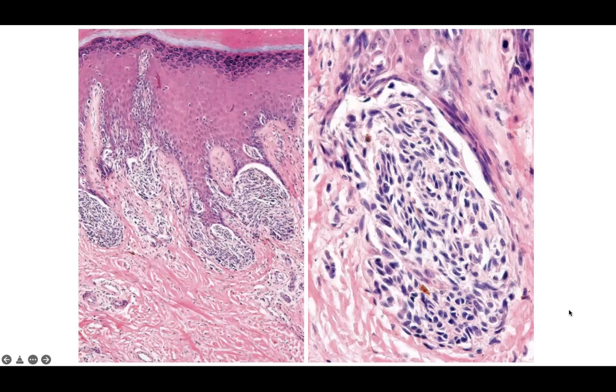And again, I'm not using PRAME as 100% here. I'm just saying that in a high number of acral melanomas, even the cytologically bland looking melanocytes can have an immunophenotypic atypical expression of antigens that are associated with melanoma, such as PRAME or HMB45.